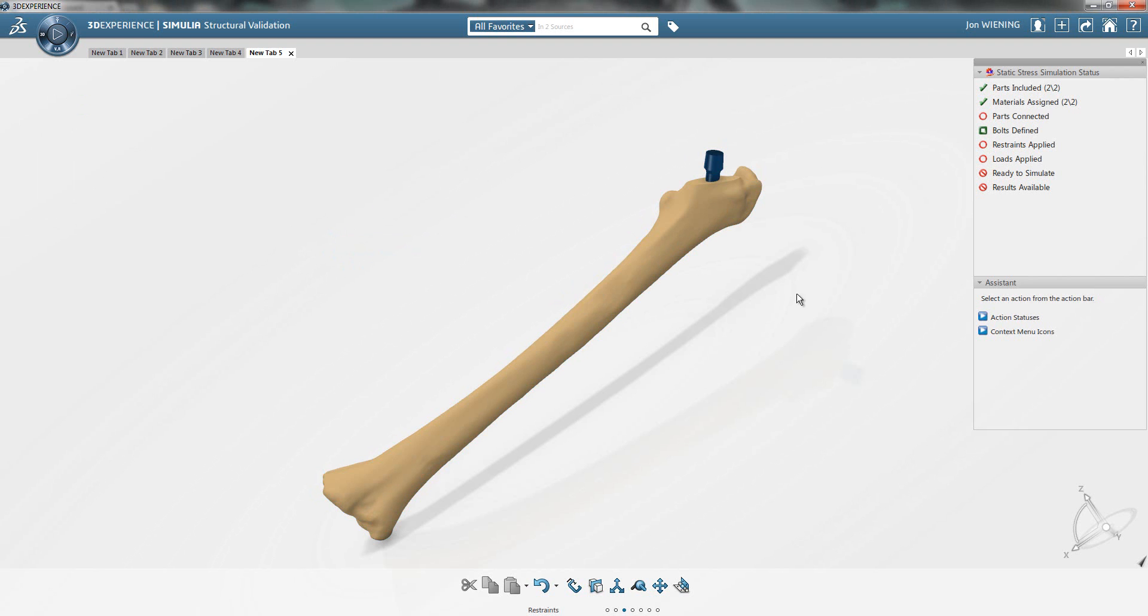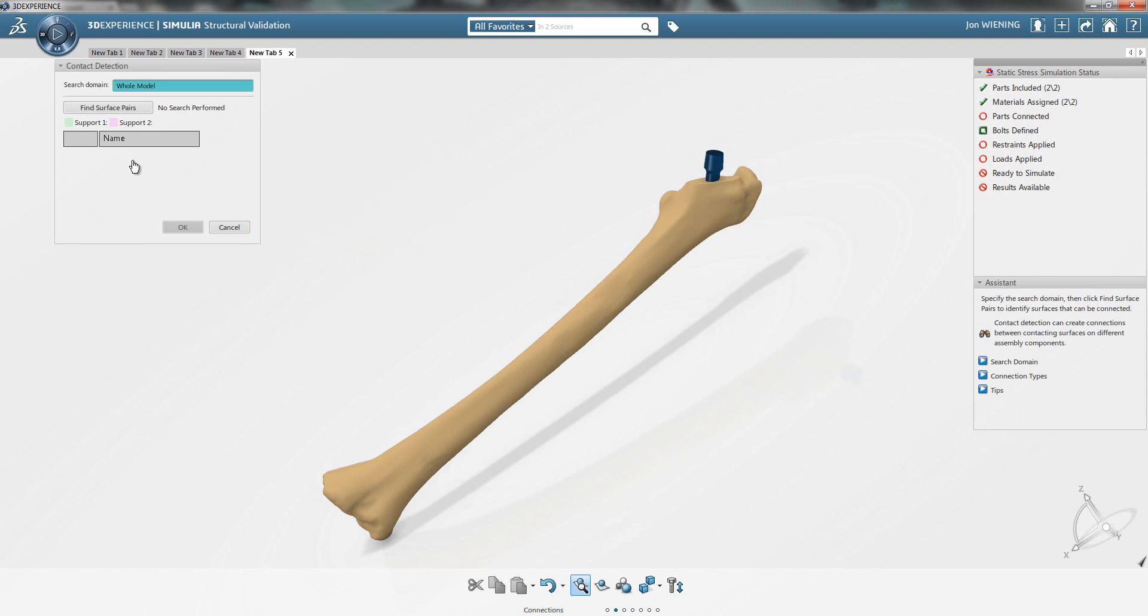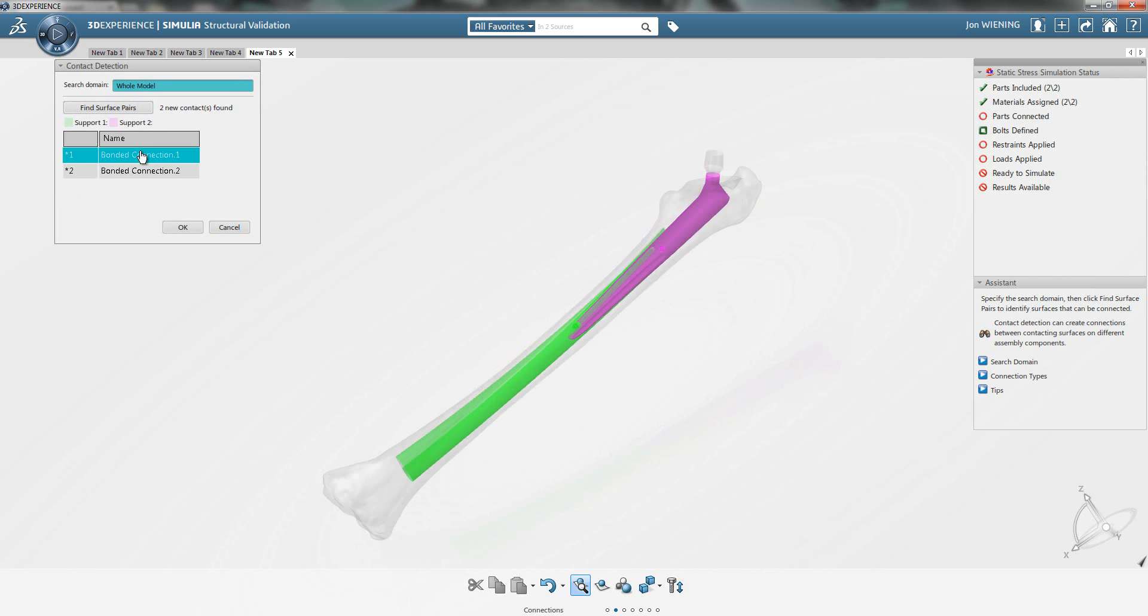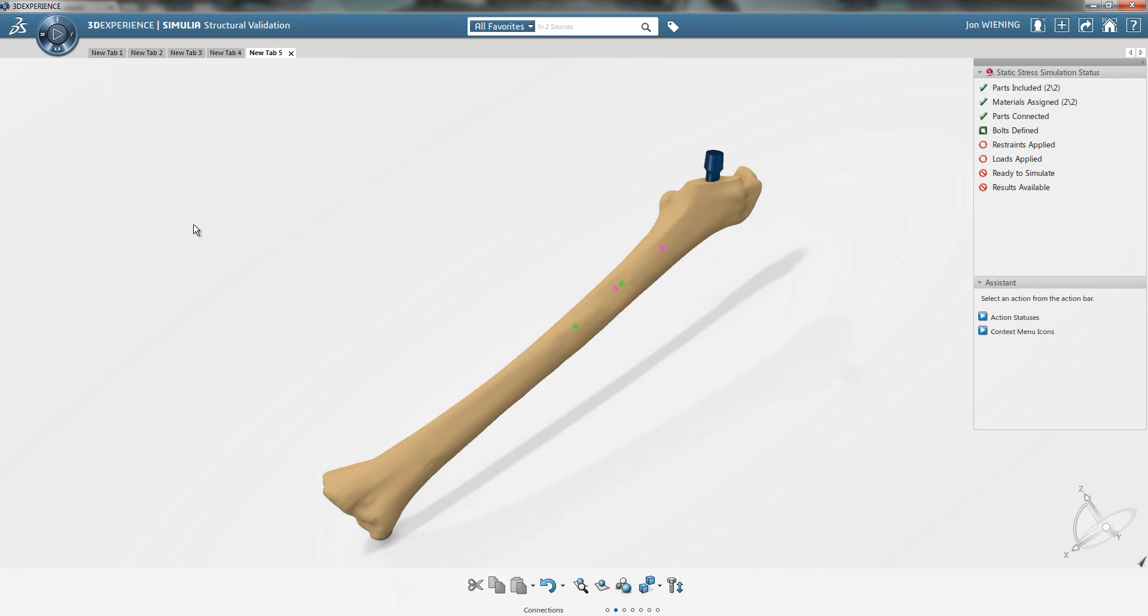The parts are not yet connected, so that will be our first step in setting up the simulation. I want to set these up using a bonded interaction. I'm going to use the automatic detection tool to find pairs of surfaces that are touching and then determine if I want them to have a bonded connection. In this case, I want both of these surface pairs to behave as if they're completely bonded because it's a cemented connection that's actually occurring in the model.